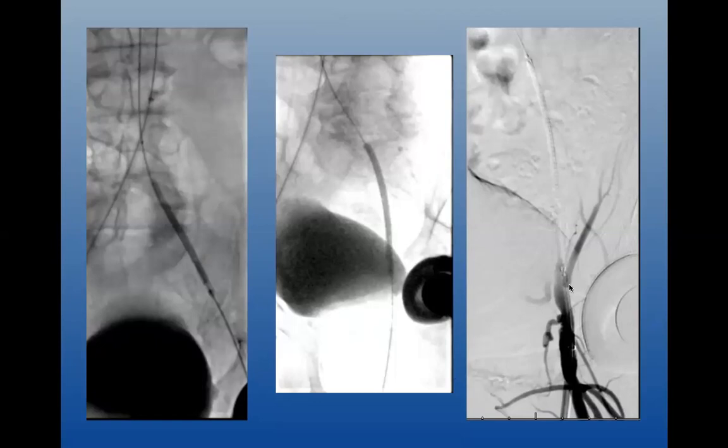We talked about that. I did an angiogram to make sure I don't cover this huge deep circumflex iliac or this inferior epigastric. You can see the status of the common femoral artery, pretty normal looking. Looked normal on ultrasound as well, just minimal plaque really. And then here's the distal part of a covered self-expanding stent. In this case, I'm using a Viabahn because I thought that it would give me precise placement, and it was covered and self-expanding and it would do well. And I made sure that I didn't cover those collaterals.